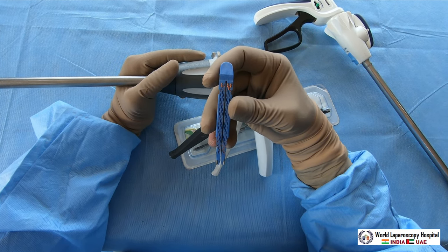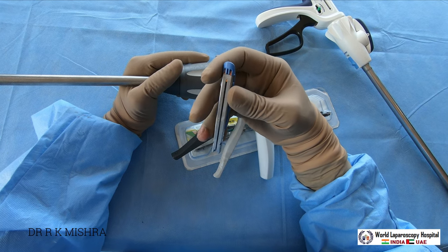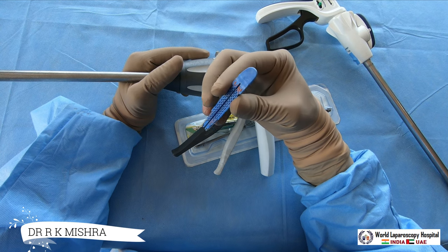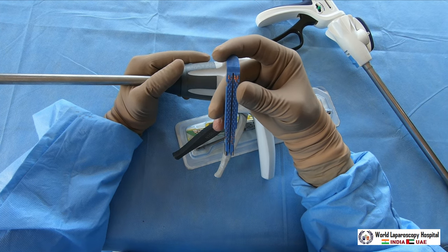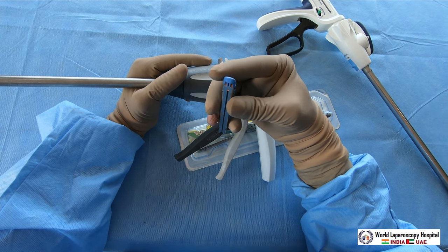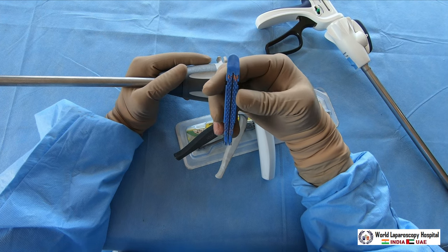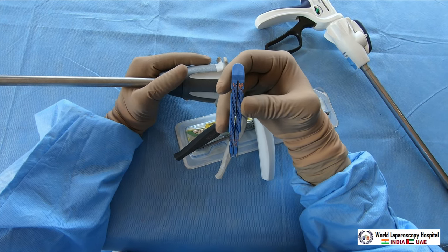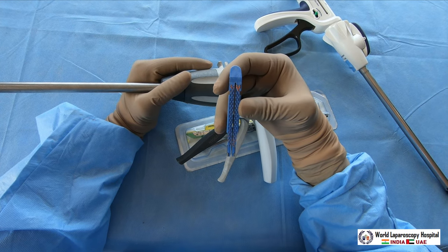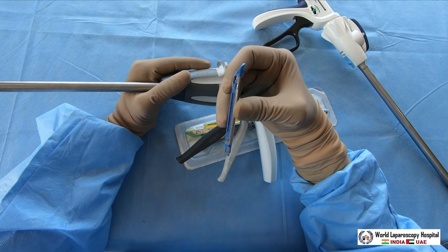You can use the blue cartridge for mini gastric bypass, Roux-en-Y gastric bypass, appendicectomy, or Meckel's diverticulectomy. Green color is used generally for muscular or thick tissue, like in the antrum during sleeve gastrectomy. White color is used for vessels - for example, if you want to do a splenectomy or nephrectomy, you should use the white cartridge.